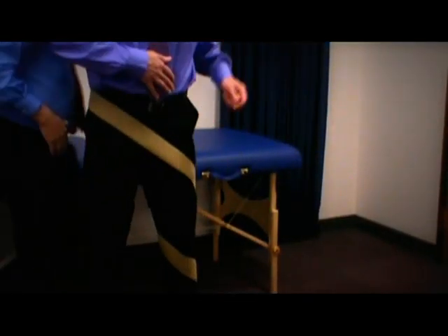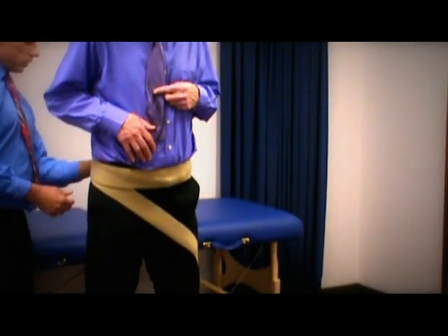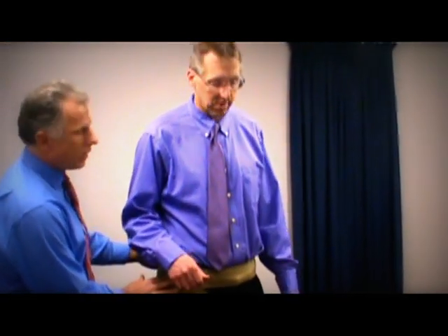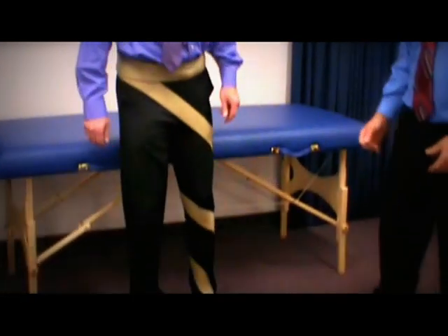But yeah, you do the wrap around, roly-poly thing here, and you keep coming, and there's a Velcro strap right there. Does that feel tight, Bob? It feels tight, but it feels good. It should not be a problem at all. There should be some tension in there. If you put your finger in there and snap it, you're going to feel it, but you're not going to wrap it so tight to cut circulation.